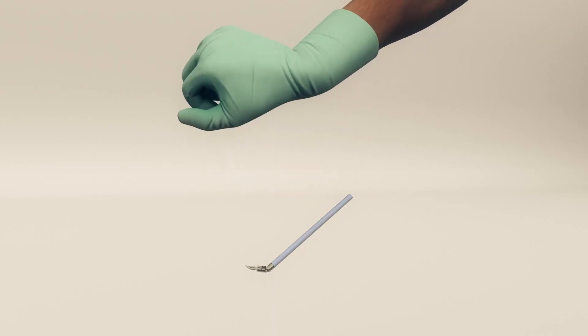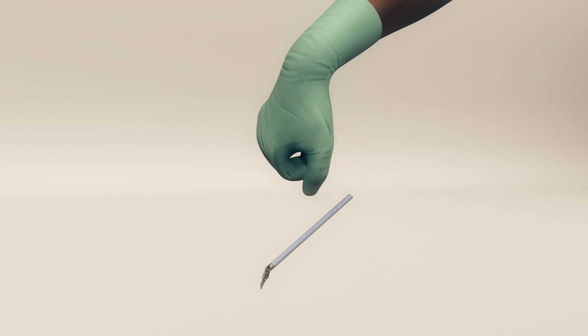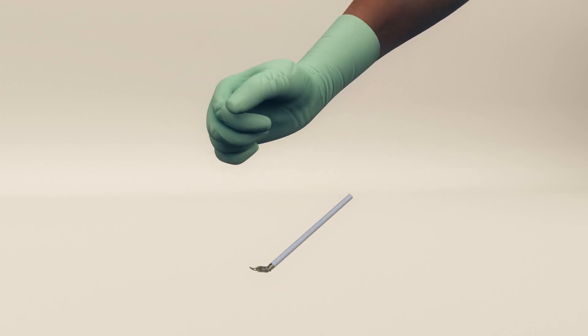The robot does not function autonomously, but rather translates the exact motions of the surgeon's hands to miniature tools on the ends of slim instruments.